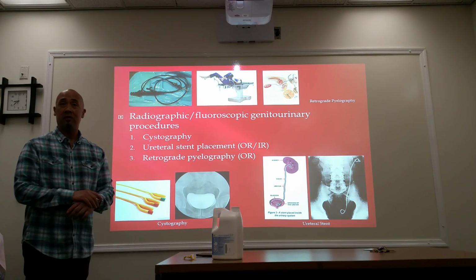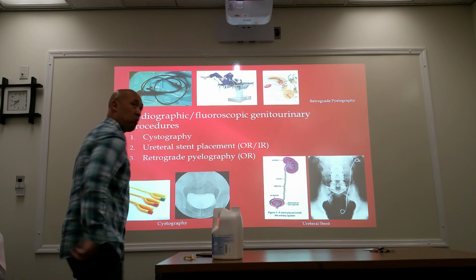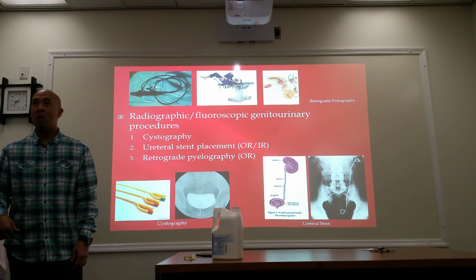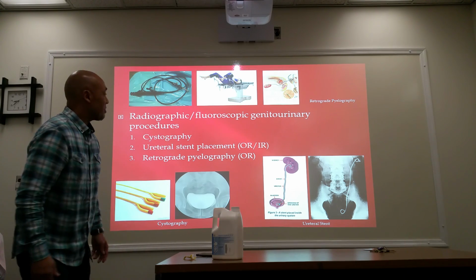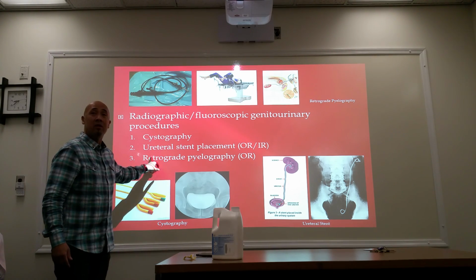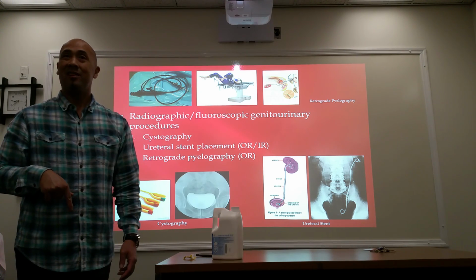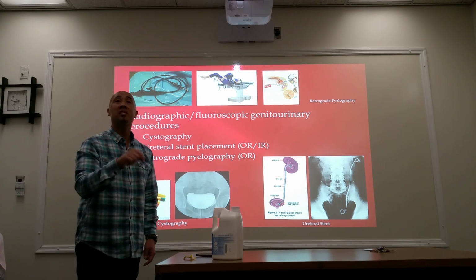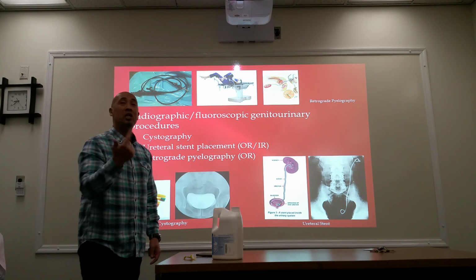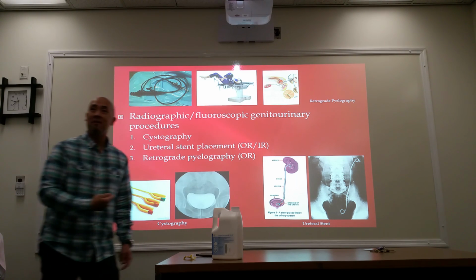How is this inserted? Well, it's inserted through your back. Why your back? Where are your kidneys located? In the back. This is done either in the operating room, but we do it mostly in radiology. So we'll place our patient prone, face down. We will prep the surgical side and do an incision from the back and into the kidney.